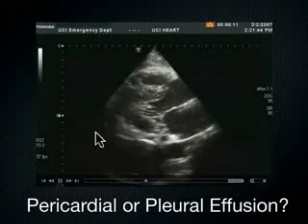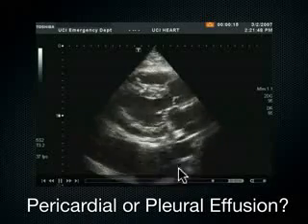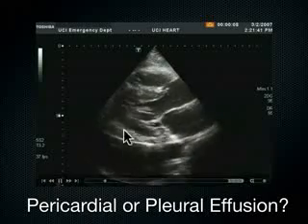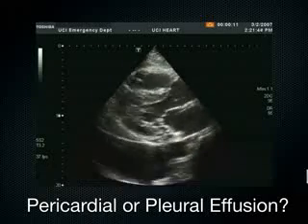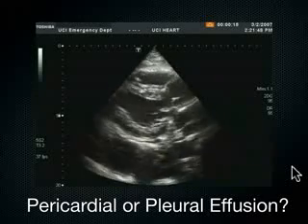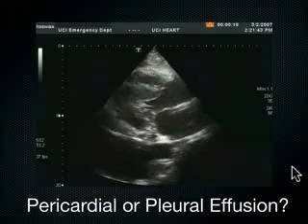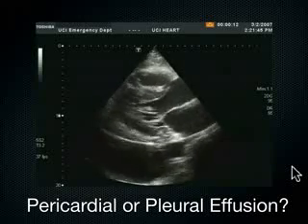The answer is yes. This is posterior to the descending aorta. This fluid comes along, as Dr. Landorf is saying here, posterior to the descending aorta, and therefore this is a pleural effusion. Confusing. I agree. It looks just like a pericardial effusion. If it wasn't for that descending aorta, how do I normally diagnose a pleural effusion on the left?